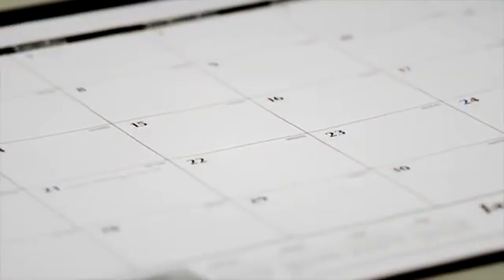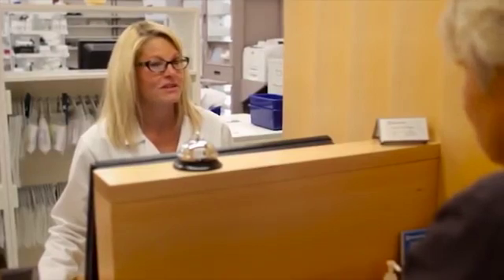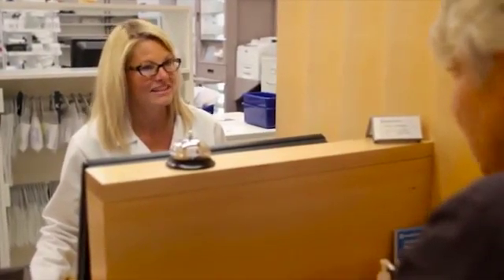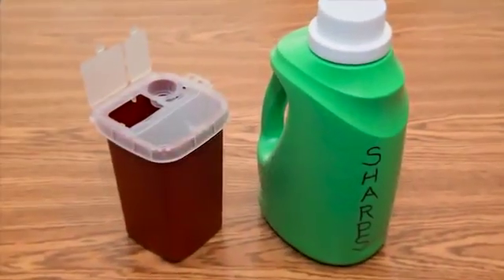Most insulin is good for 28 days once it's opened. Check with your pharmacist or read the drug insert for exact instructions. Always check your medicine type and the expiration date printed on the box before you leave the pharmacy. Do not use insulin if it has lumps, is discolored, or has been frozen. Place used insulin syringes and lancets for blood sugar testing in a hard plastic or metal container with a screw-on or tight lid or a commercial sharps container.